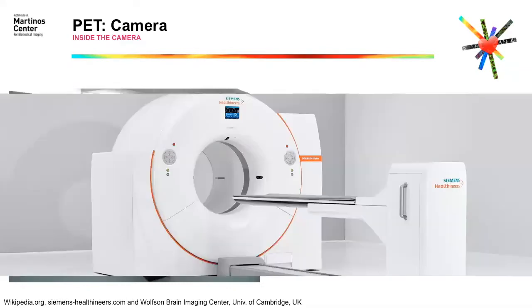Newer scanners are a little bit fancier and much more appealing visually and also professionally from the point of view of how they work. And in this case, it's not a PET standalone scanner, it's a PET CT scanner. And I will mention later on why we want to combine a PET with something, in this case with a CT, or in our case, with MRs.